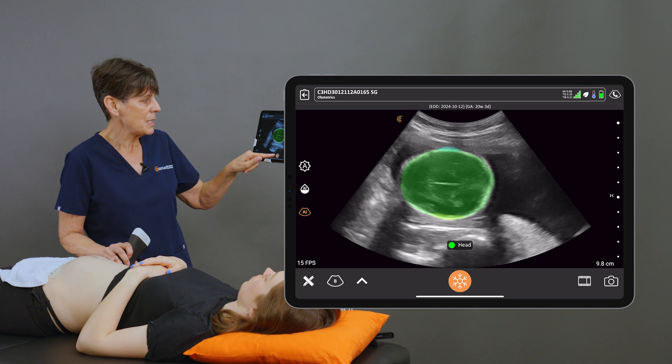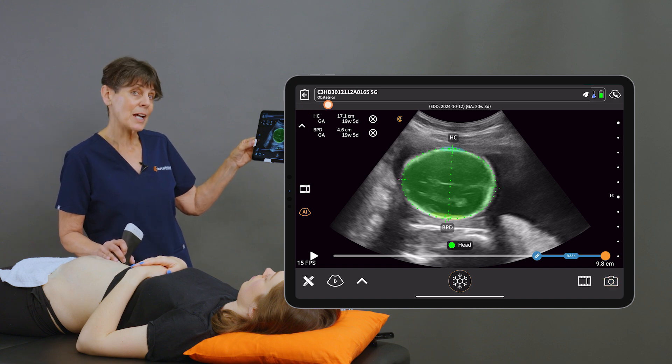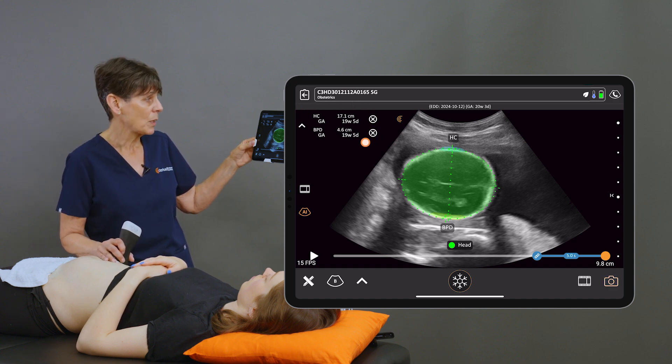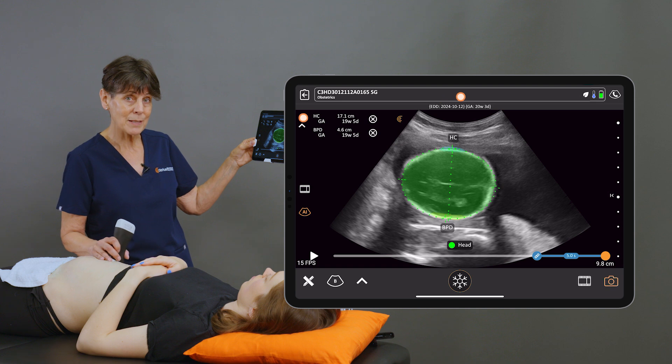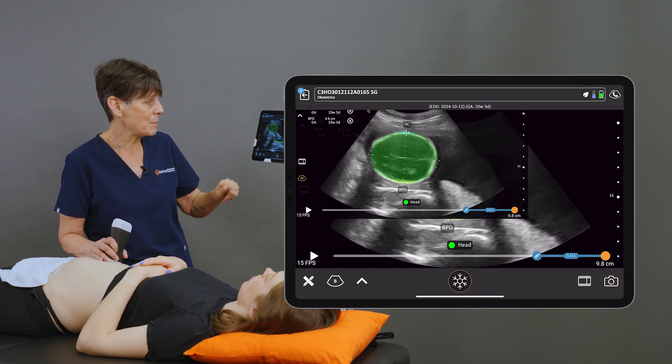So if we get a nice image, I can freeze it, and the AI is going to place the calipers for me. These are both indicating a gestational age of 19 weeks and 5 days, which corresponds well to the estimated due date based on the first ultrasound. So I'm going to take that image.